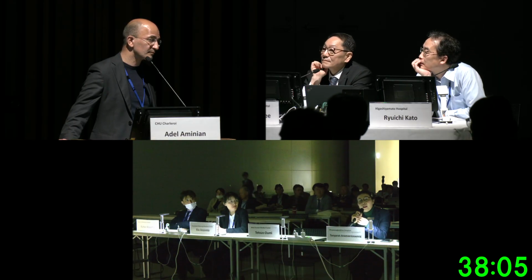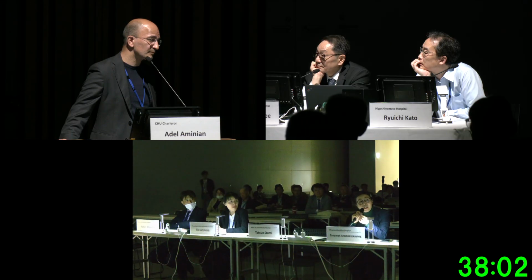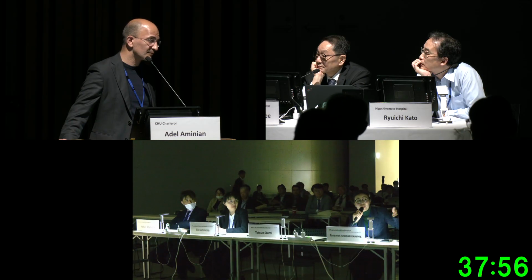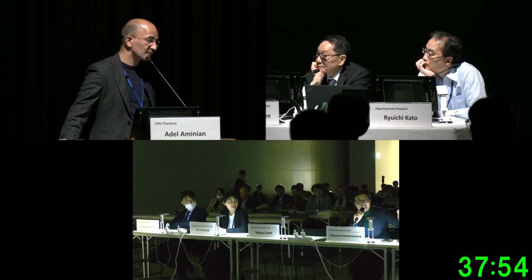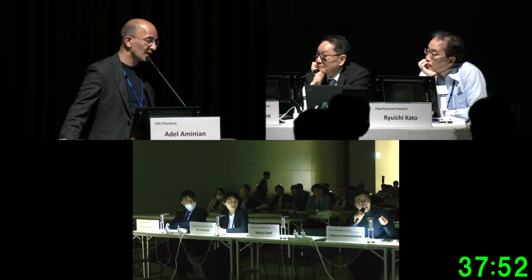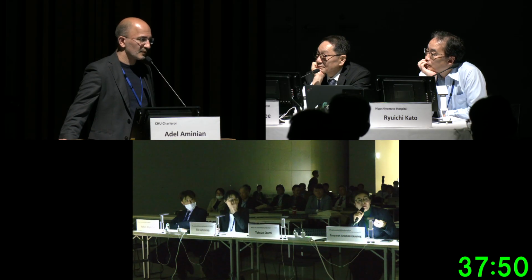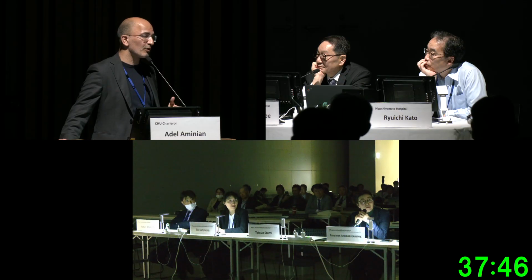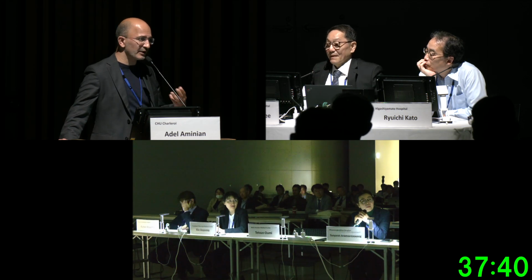Did you find any problem with imaging guidance when you transitioned from the angiographic route you previously practiced at the start? Any point that you would tell the beginner? Of course, there is a learning curve. You need to know how to use the echo, how to get a good longitudinal view, how to get a good axial view.